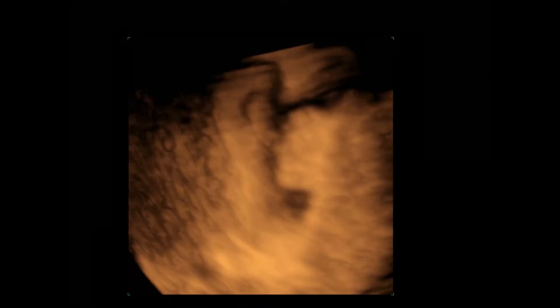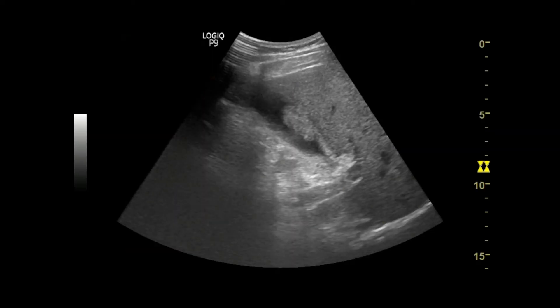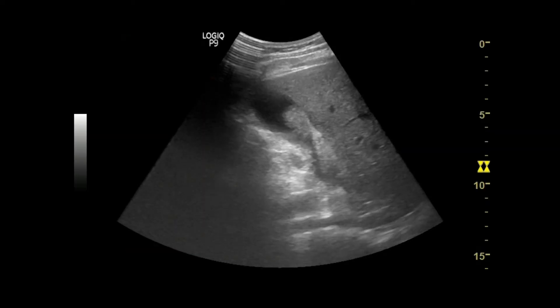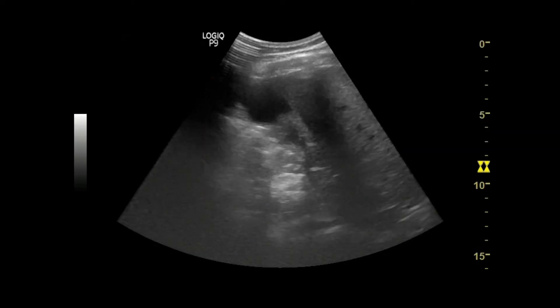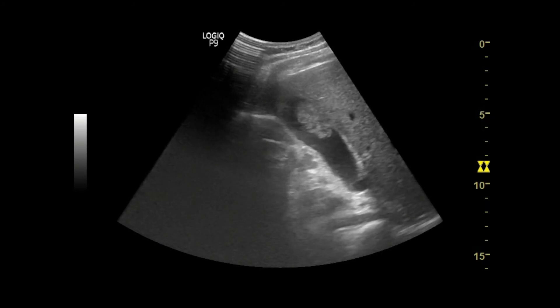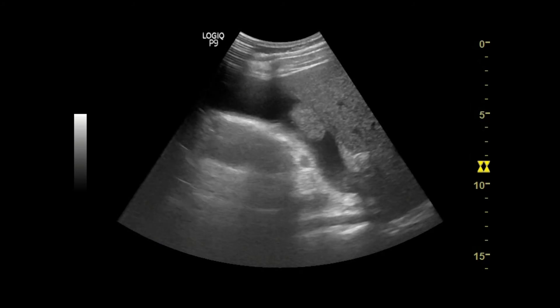On 3D ultrasound, the mass is still noted attached to the gallbladder wall. Now, see on real-time — there is an irregular mass attached to the anterior gallbladder wall.